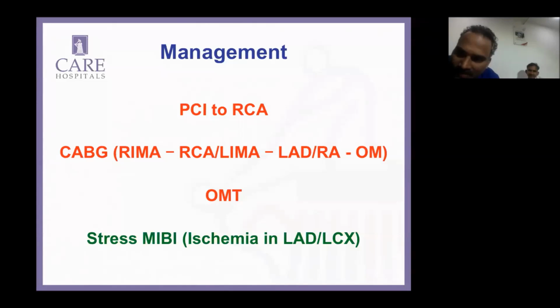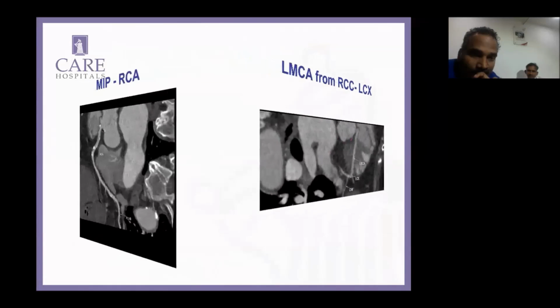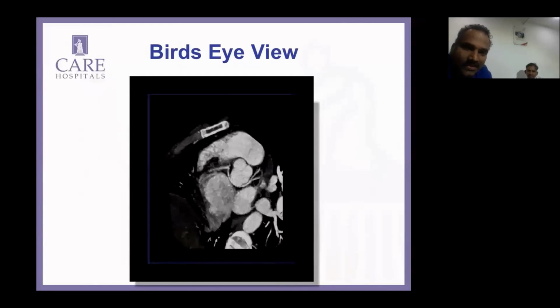despite I do angio, there is a problem for me in this case. See, in all such cases where the coronary is originating, the immediate course is parallel to the aorta, not perpendicular. For participants to understand, you can show the section, the bird's eye view. Yeah. So see where your coronary is almost going parallel to your aorta.